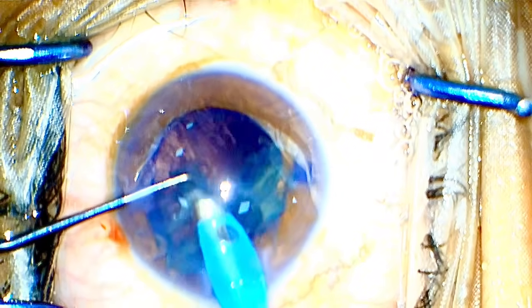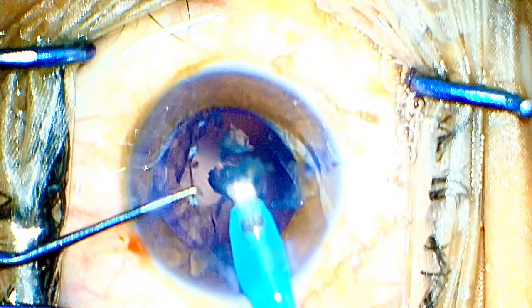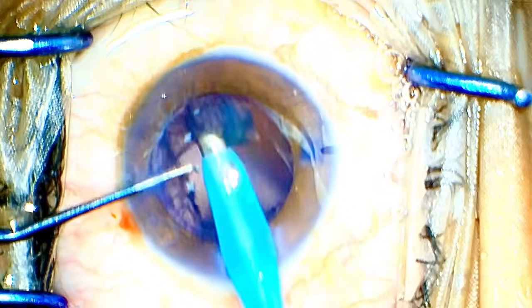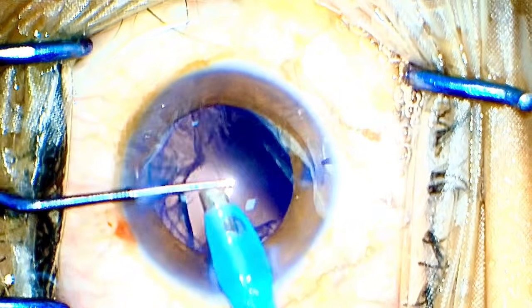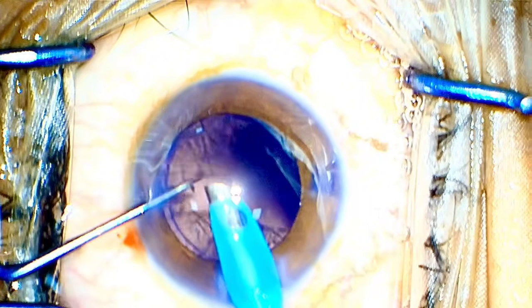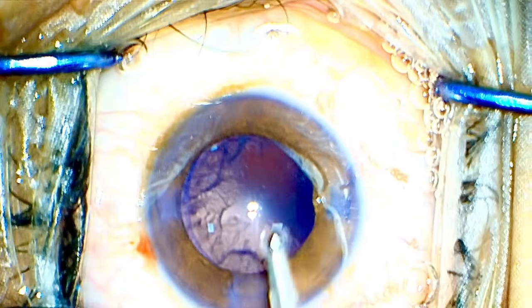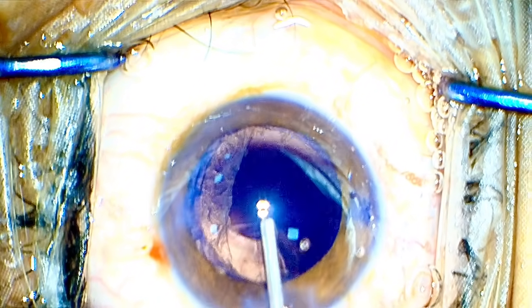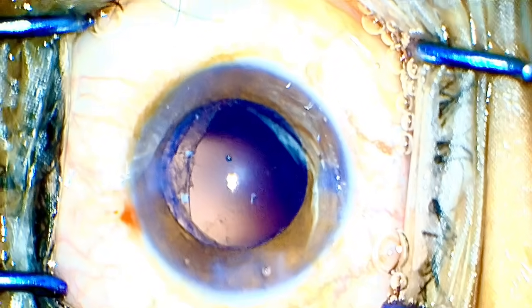I've noticed these diabetic patients don't dilate well either. So in those cases also, prolapsing one pole out of the bag and causing a temporary fixation of the pupillary size is a very easy technique, because once the pupil is small in diabetic patients, it's always risky to impale the belly of the nucleus and go for a direct chop. In those cases also, the nucleus does not chop well and there is a risk of PCR.